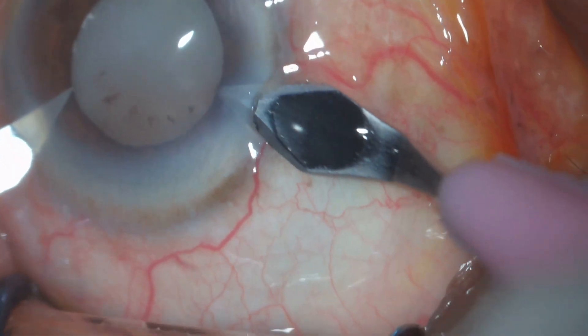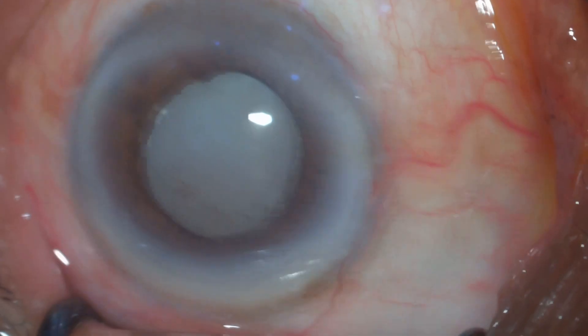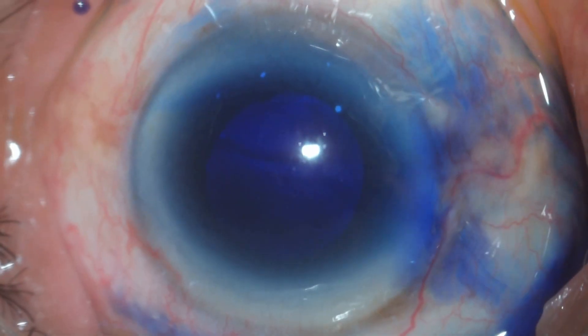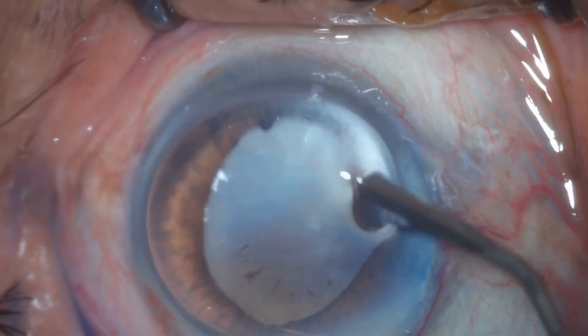Hello friends, my name is Dr. Lee Singel and today I'm going to present a case with hypermature cataract. This patient is having a hypermature cataract and presented with high IOP — a phacolytic scenario — and after giving a few pressure-lowering medications, we have taken this patient for surgery.